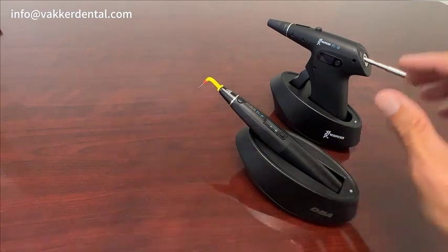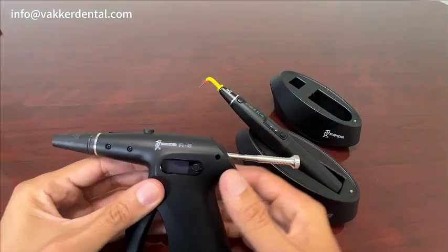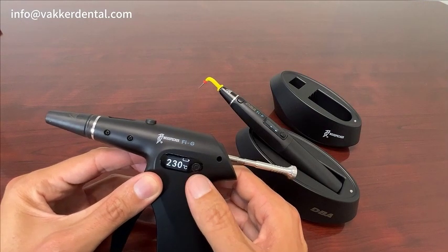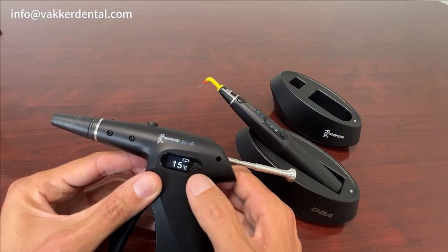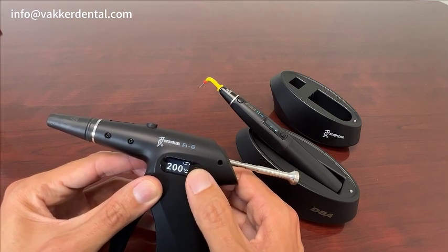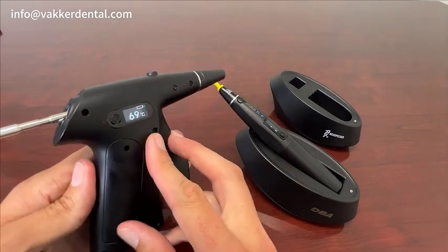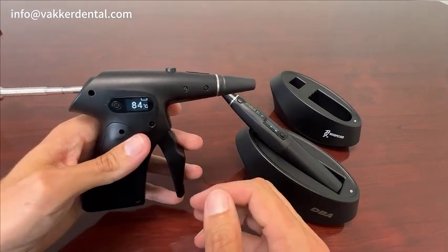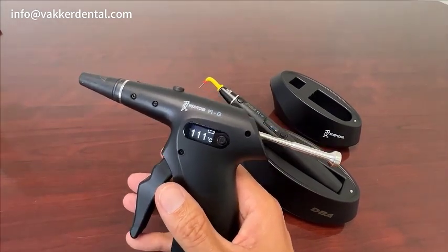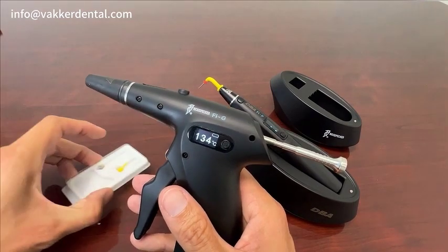Let's jump to the gun. Very similar situation — turn it on. Battery's a little low. You can change the degrees: 150, 180, 200. This has a display on both sides, so whether you're left-handed or right-handed, it will work for you.